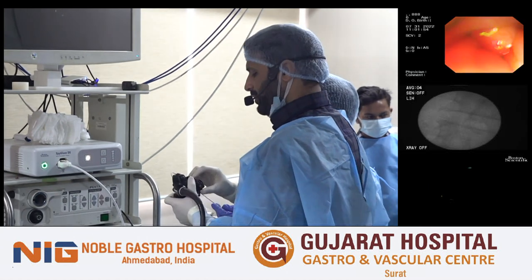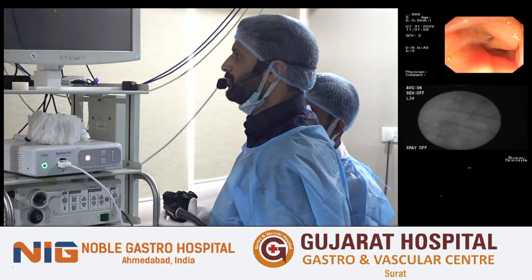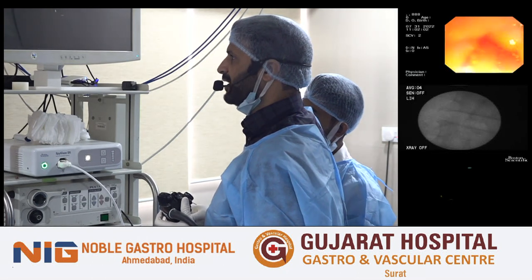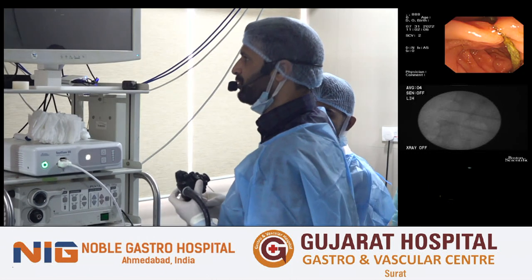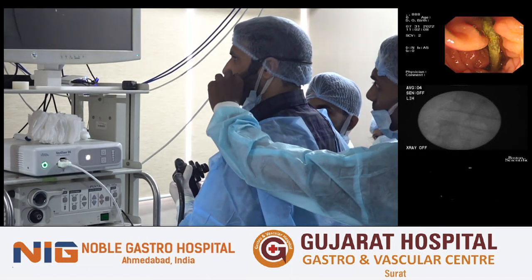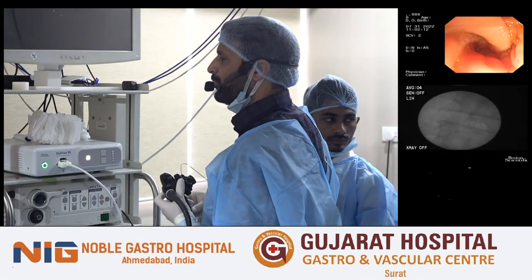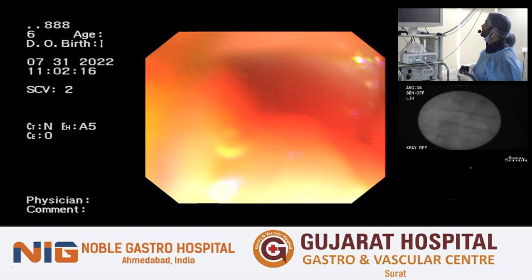Okay. So this is a 60-year-old man and he's got CBD stones. He presented with obstructive jaundice 2-3 months back. He had an ERCP at that time, and a stent was placed. He's got a 1.5 centimeter stone in a. Sorry, Dr. Naveen, can we have the endoscopy view? Yes.